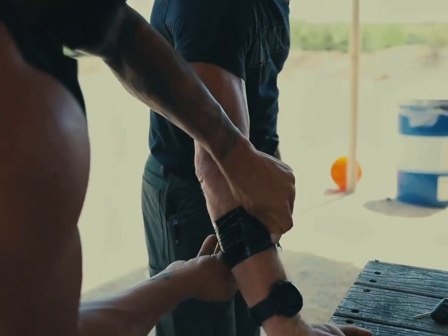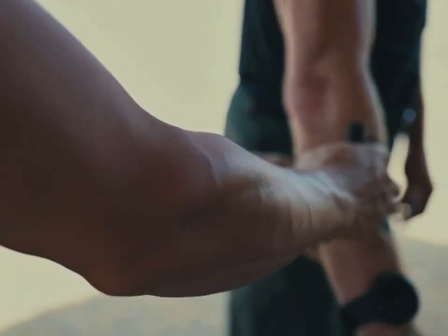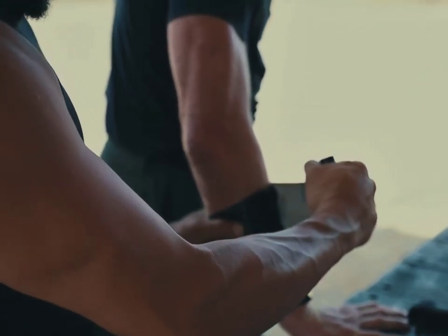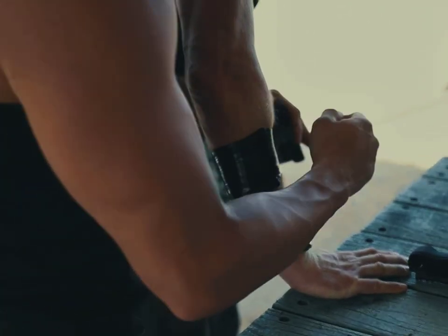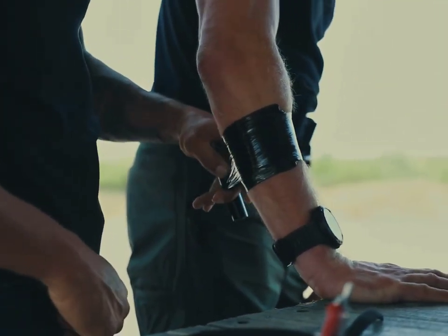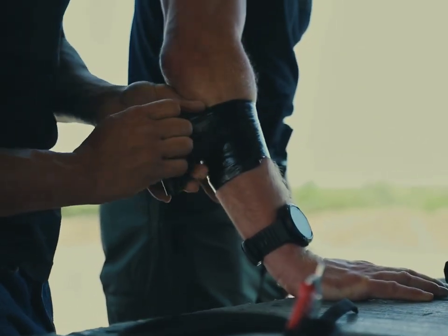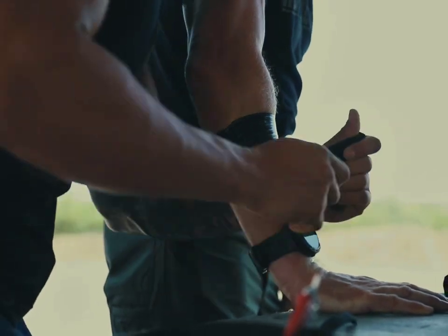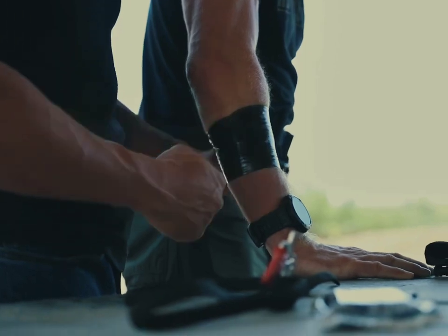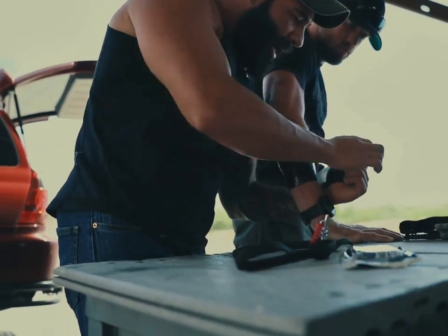You put it on the forearm — we'd go here. Once it's on and we have that first point of contact, we're going to create the pressure and cinch down. It can be a pressure bandage on top of a tourniquet. You can pull even tighter and go above the area, getting the top of that cinch down, then turn it and grab the bottom part to really close this off pretty tight.